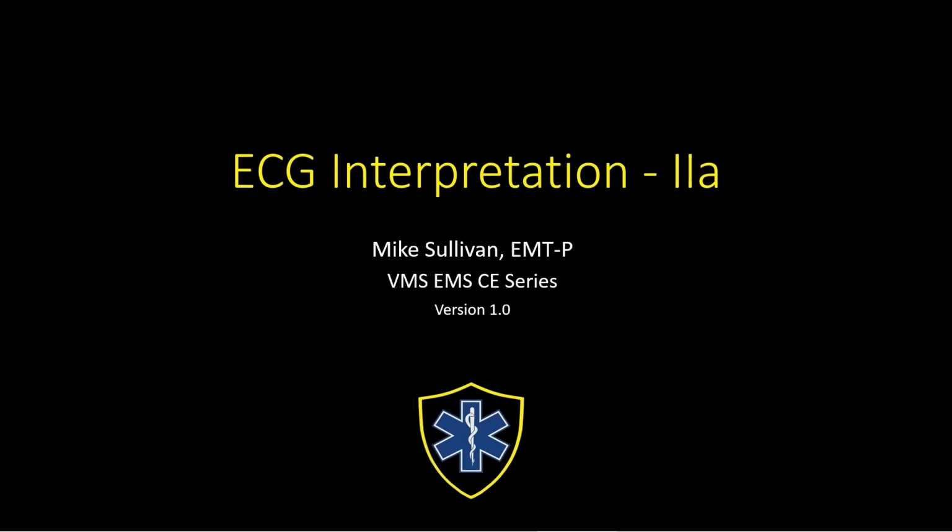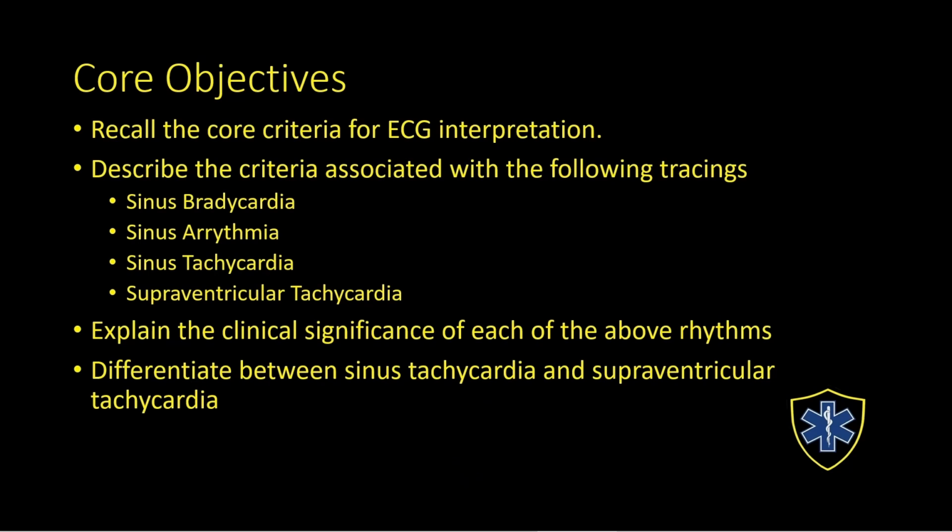I'm one of the instructors at Valor Medical Services, and welcome to ECG Interpretation 2A. In this program, we're going to be recalling some of the core criteria for ECG interpretation that we covered in Module 1. We'll also be discussing several rhythms and describing the criteria associated with sinus bradycardia, sinus arrhythmia, sinus tachycardia, and supraventricular tachycardia. We're going to then go on and explain the clinical significance of each of these rhythms and go over different ways that we can differentiate between sinus tachycardia and supraventricular tachycardia.